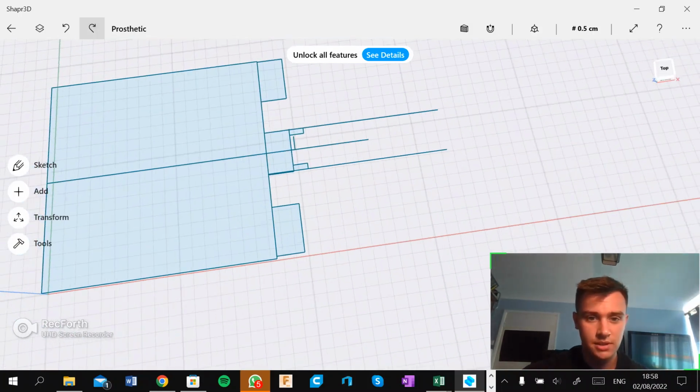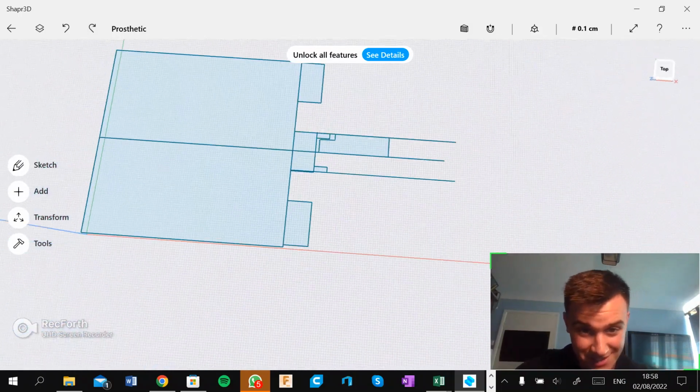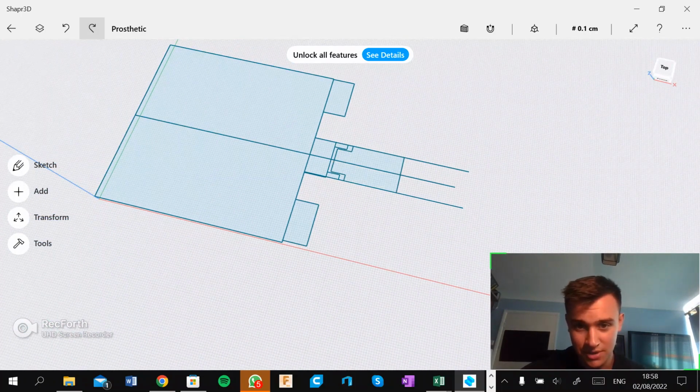There we go. Let's just reposition this. But yeah, and then you see me here building the second one, which once again that line there caused me a lot of issues because it wasn't straight. And yes, there's going to be a bit of skipping here as I try to get this to work.